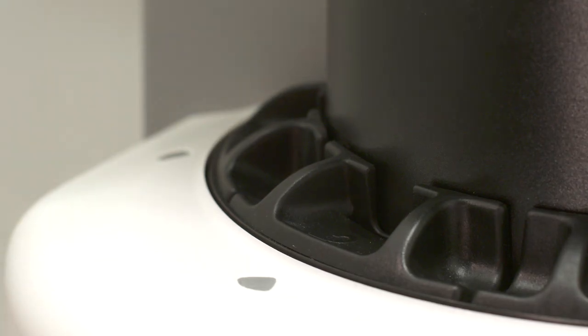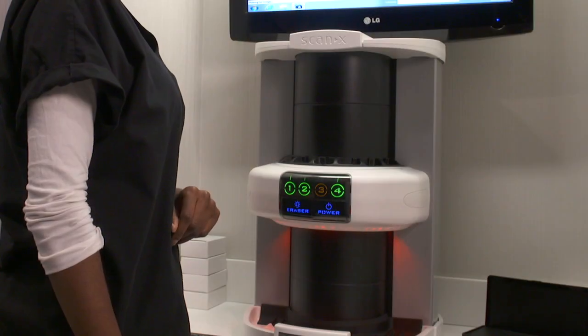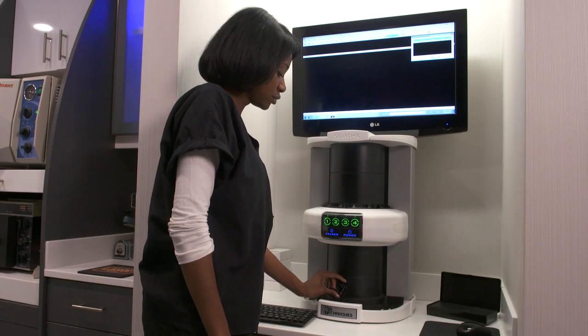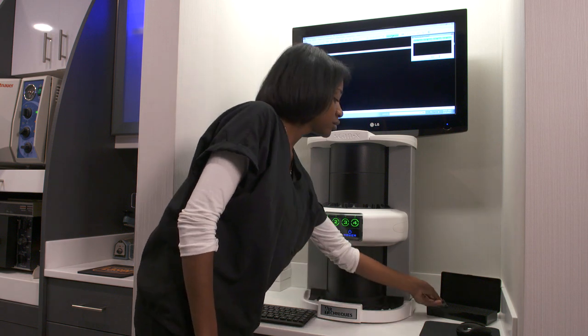You can simultaneously load up to four sensors at a time or up to two plates if using the Duo. Once the LED turns from amber to green, you can insert another sensor. Each sensor scanned will automatically erase.